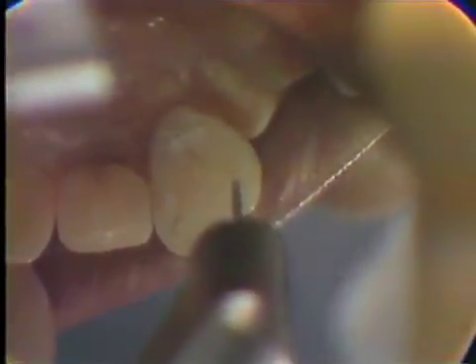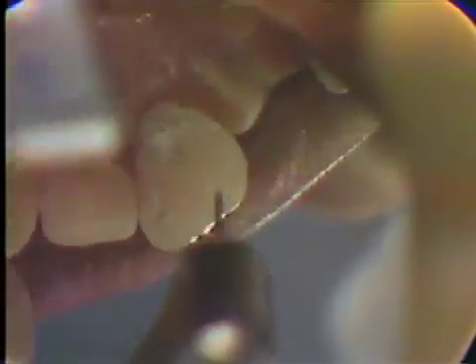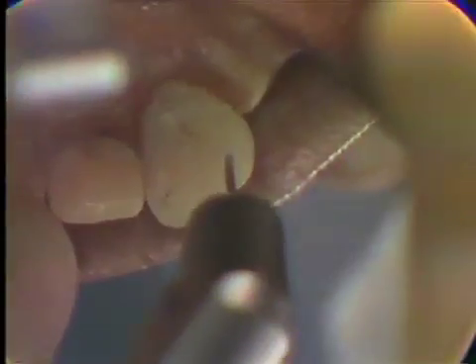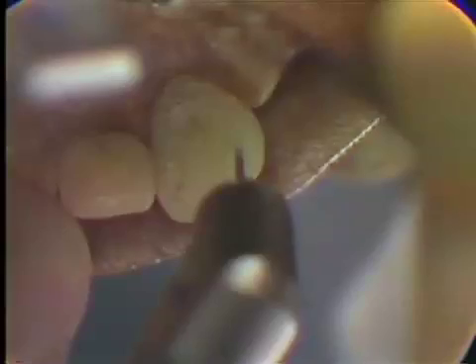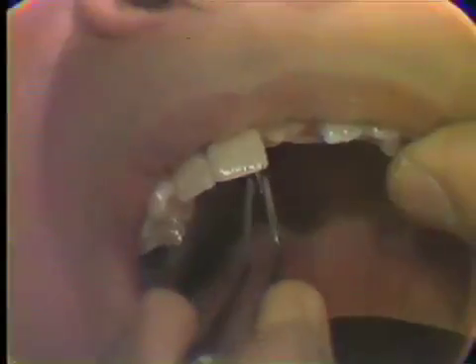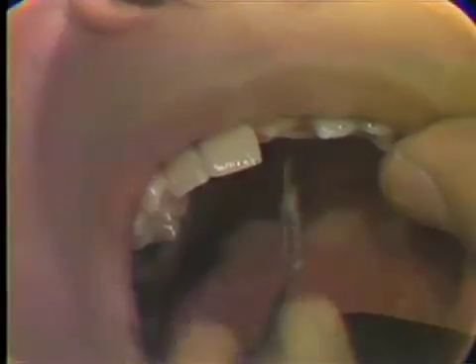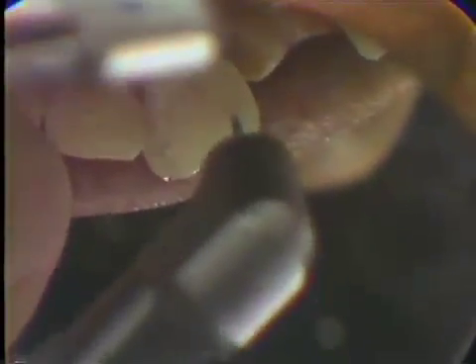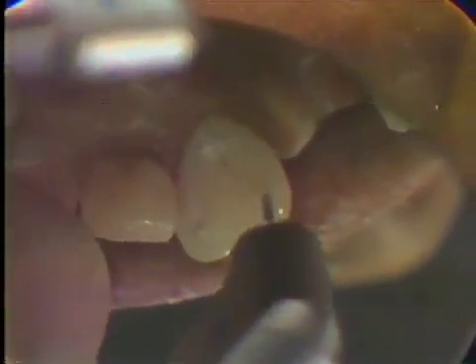This first pinhole we're going to drill to a depth of about a millimeter. We'll place a pin in to check the line of draw. The line of draw seems to be correct, so now we'll remove the pin and deepen the pinhole until it's three millimeters deep for this incisal pin. Going in the same line of draw, we'll drill that pinhole — never stopping the twist drill in the tooth, never reversing it, but always pumping it up and down so we have the proper depth.